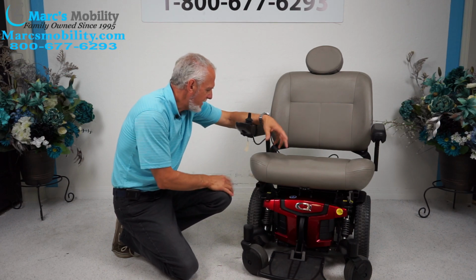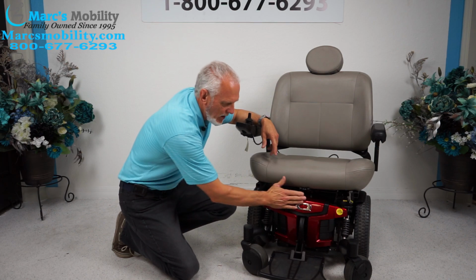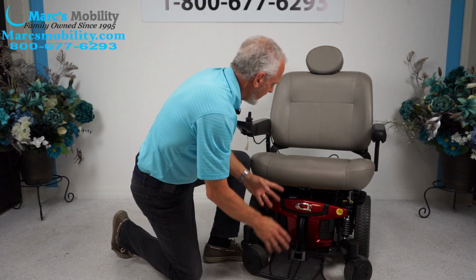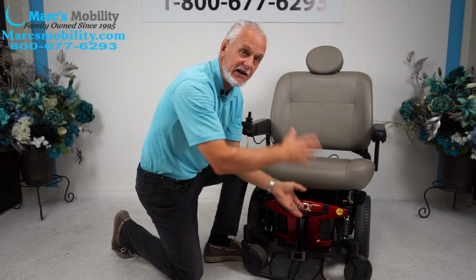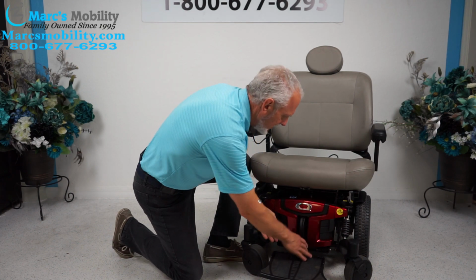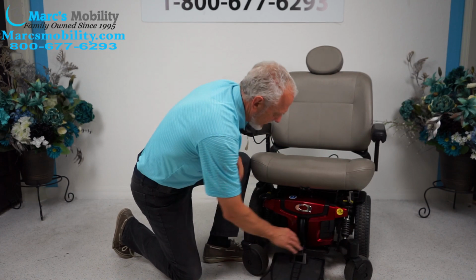Now, on all Quantum Edge power chairs, the batteries always come out from the front. Okay, so this one is no different. There are some Quantum Edge chairs that have the electric seat, the electric tilt, and they have legs in the front. The batteries still come out from here. This one's easy because there's nothing in front in your way. You squeeze the 2 handles.